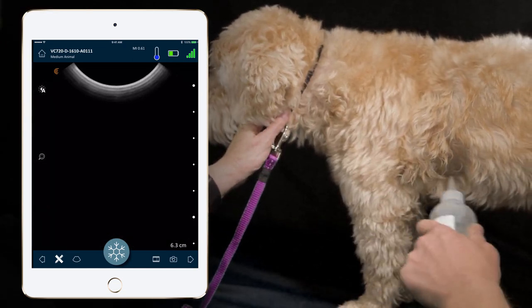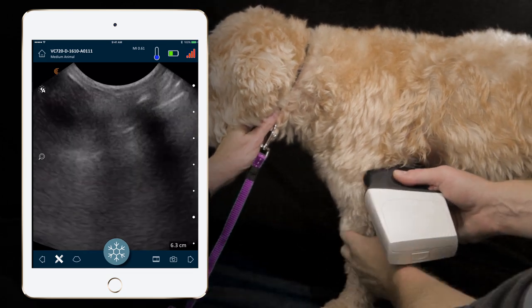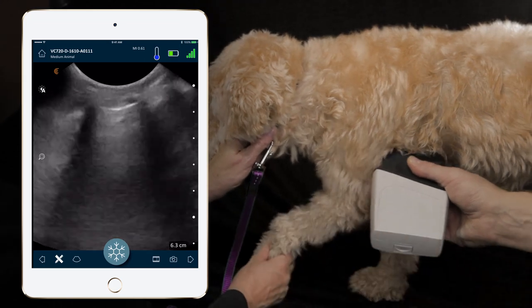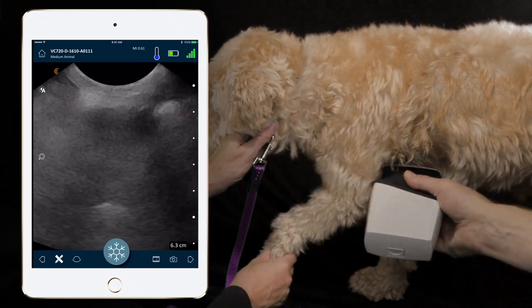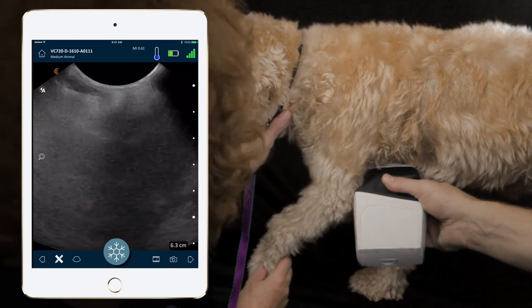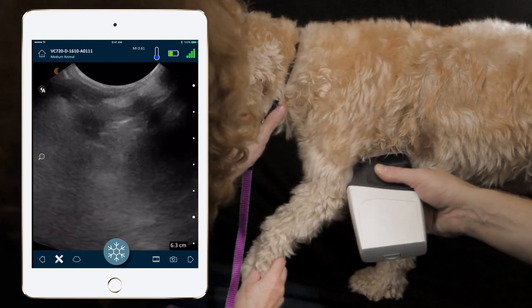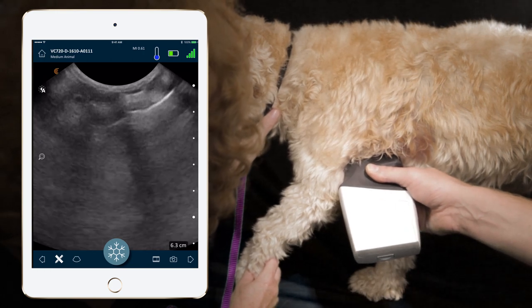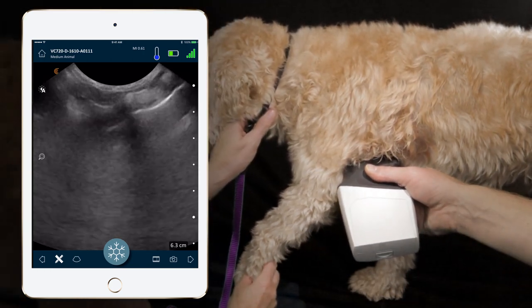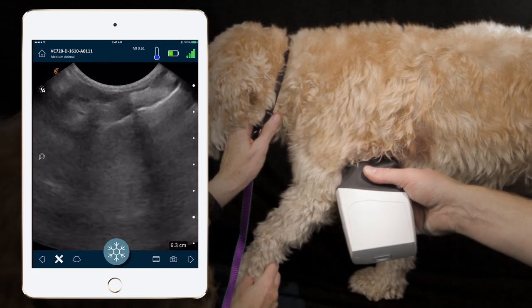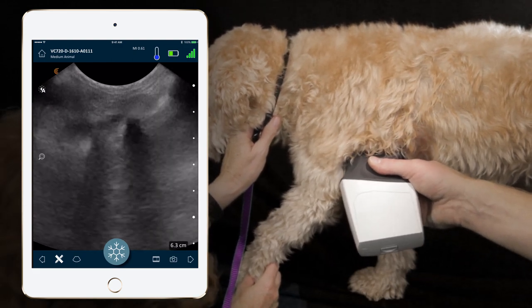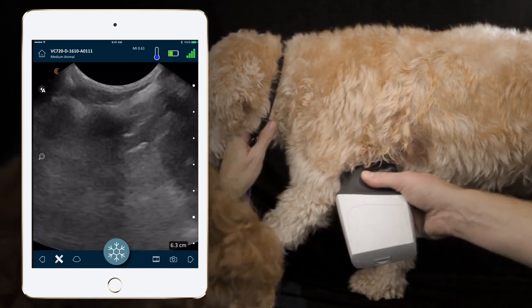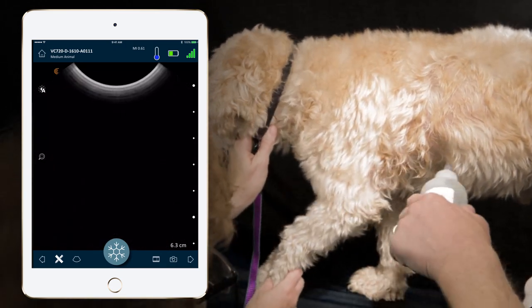Then we move more ventrally and come cranial to the heart. We'll localize the heart in our image — we can see the heart here in our view — and move just cranial to that, and a little dorsally. We can see the glide sign at this site. We want to make sure we don't have any B-lines, so we can move the probe around caudally, ventrally, dorsally, cranially, and caudally, looking for the presence of B-lines or pleural effusion.